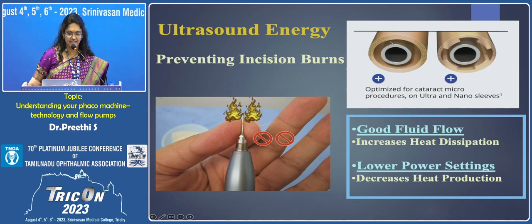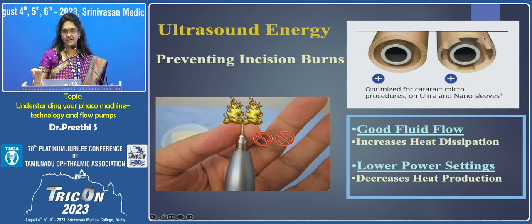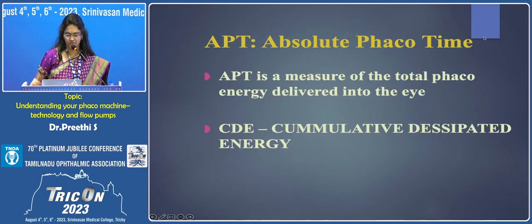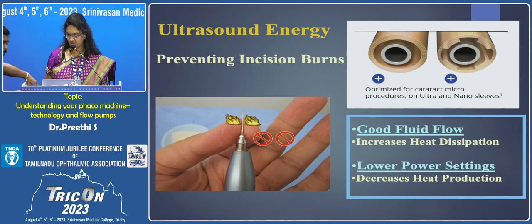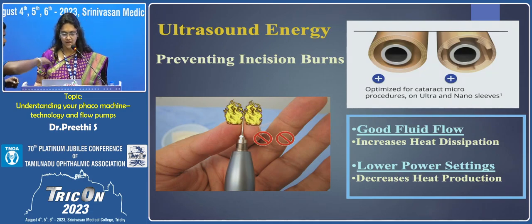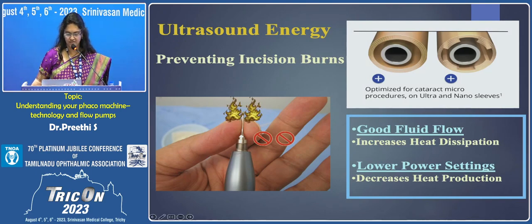And this is a sleeve which is around this tip, which will help in having the flow through it. And the heat which is dissipated does not go directly into contact with the wound area. And this is a newer tip where it also has these four bridges. It helps in not making the sleeve move much, and also this extra gap which is seen there helps in having a more irrigation flow. If somebody gives me a pointer, it would be better. Do you have any pointer with you? Yeah. So this is good fluid flow, increases heat dissipation, and yeah, thanks. And a lower power setting will decrease the heat production.